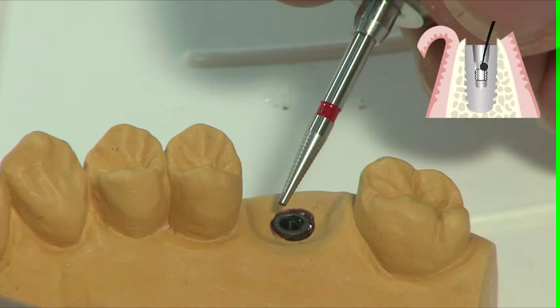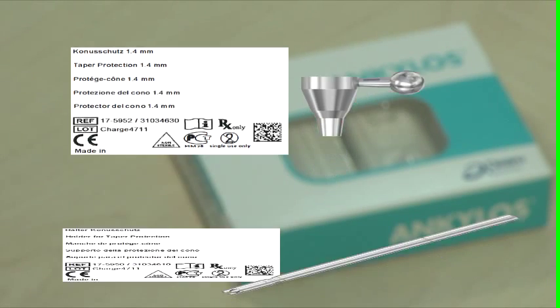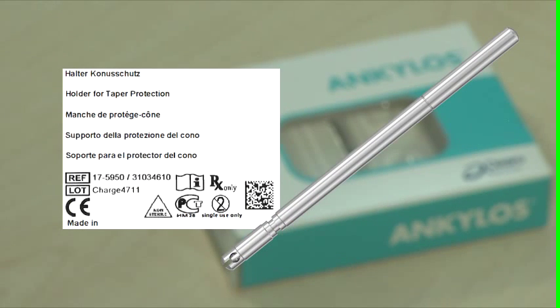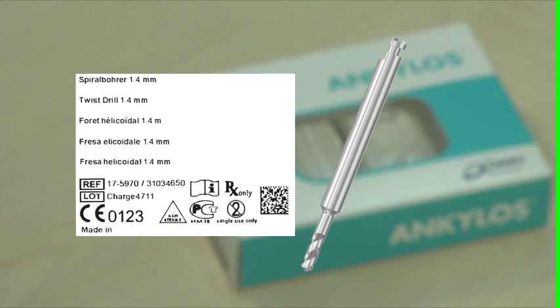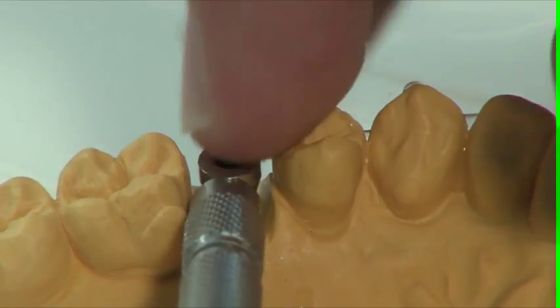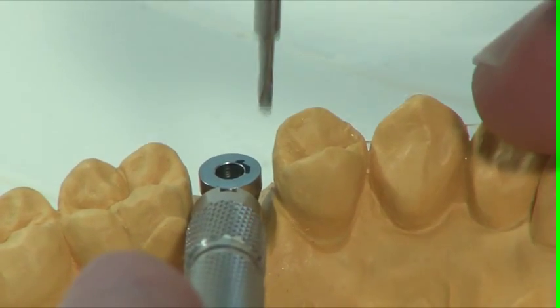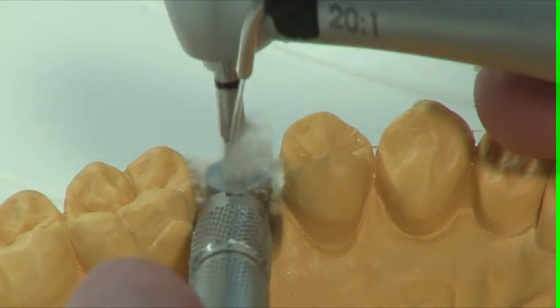At this point you can attempt to grasp and remove the remainder of the screw using the unscrew instrument. Should this prove unsuccessful, proceed with the twist drill 1.4. Use the twist drill 1.4 just like the crown cutter, the only difference being that the twist drill 1.4 is turned clockwise.